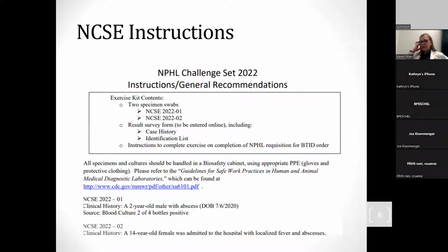And a list of identifications that you can choose from. Now, we did not do the last one. I apologize. I forgot to take that particular step off this time. Sometimes we do add special tests. For instance, I might ask you to do a shipper's declaration, not to send the organism, but to do a shipper's declaration as if you truly had to send us a category A.